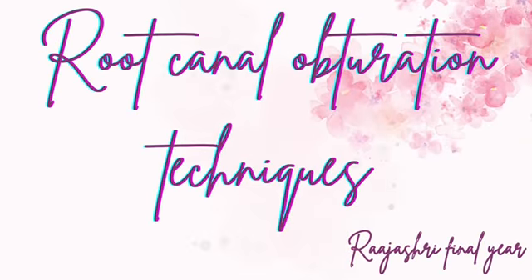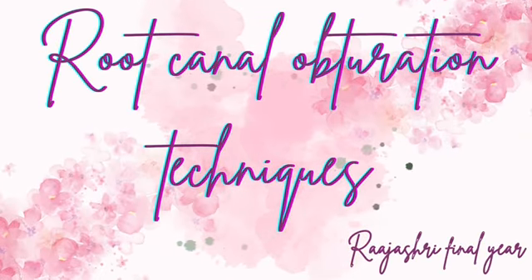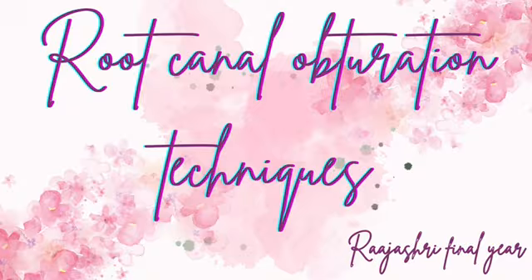Today, I will be presenting on an important aspect of endodontic treatment, that is, root canal obturation technique. As we know, the success of root canal therapy does not depend only on cleaning and shaping of the canals, but equally on how well we seal the root canal system.